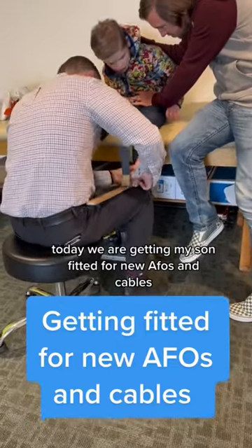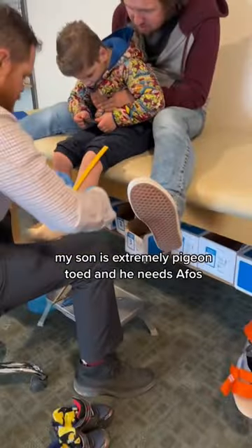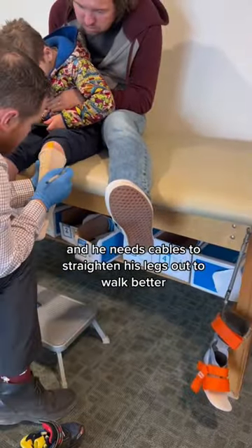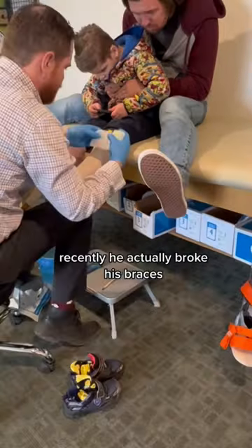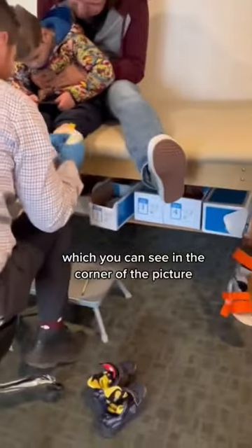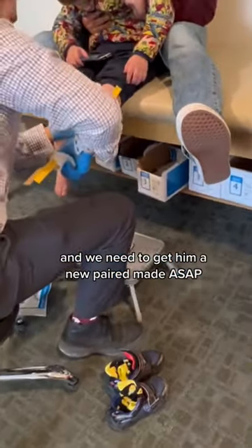Today we are getting my son fitted for new AFOs and cables. My son is extremely pigeon-toed and he needs AFOs and cables to straighten his legs out to walk better. Recently he actually broke his braces, which you can see in the corner of the picture, and we need to get him a new pair made ASAP.